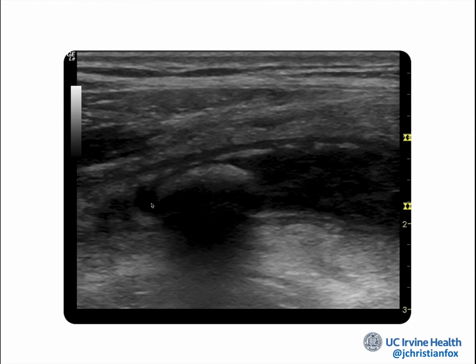This is a fecalith right here. So the appendix is swollen and it's over here, sort of coming off the screen. It's definitely dilated. From 2 to 3, that's 1 centimeter. So you can imagine this is almost a centimeter. It's definitely more than 6 millimeters. This is pretty dilated. And this is the cause of the appendicitis.